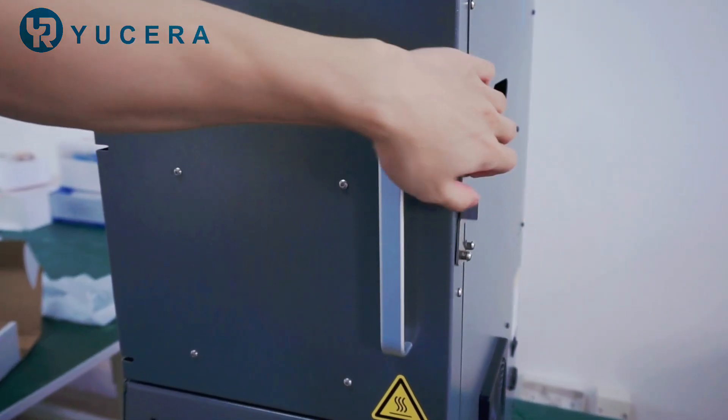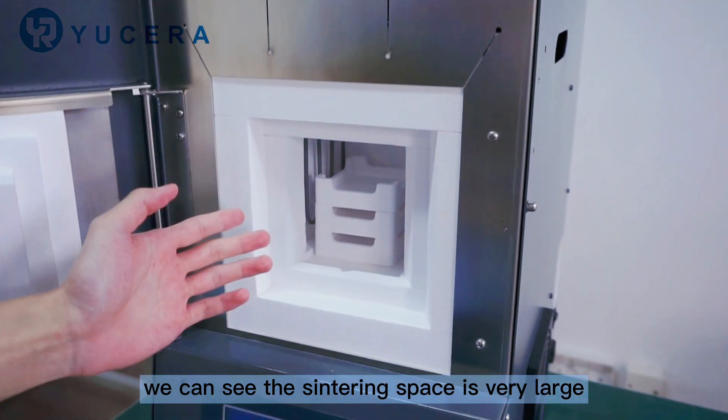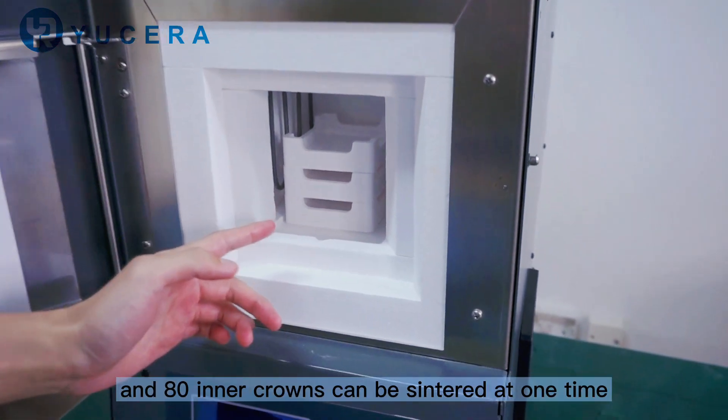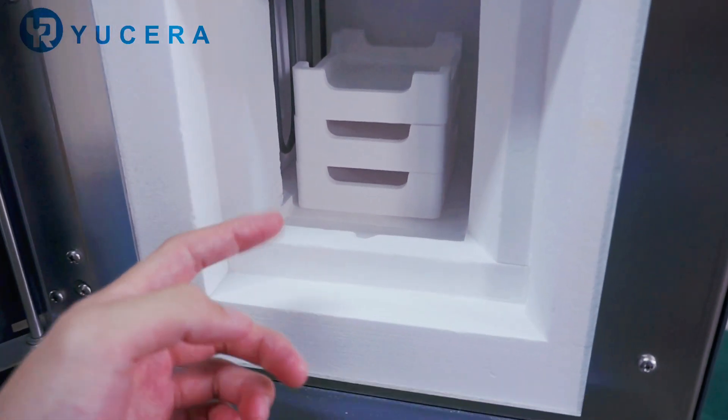Open here. We can see the sintering space is very large. It can put a three-layer sintering box and 80 inner crowns can be sintered at one time.